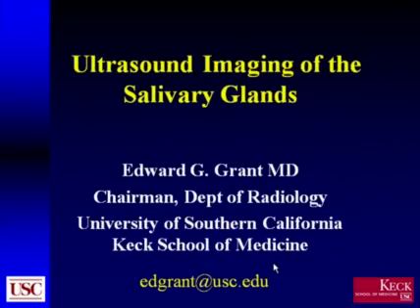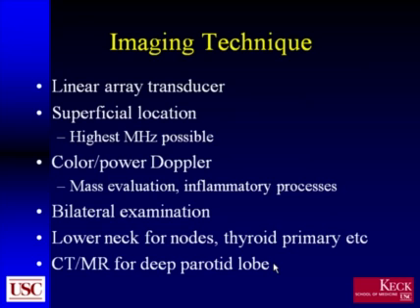Okay, so I'm going to be talking about ultrasound imaging of the salivary glands, and as I mentioned, we're going to end this by bringing in a little bit about how we do biopsy techniques in this area and in the surrounding masses that may occur.